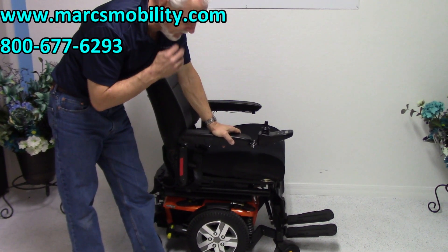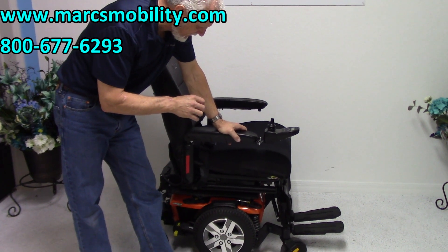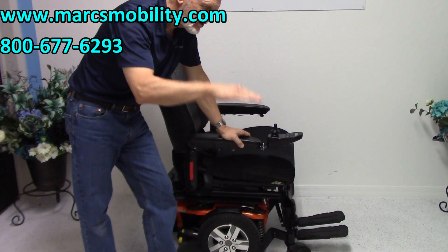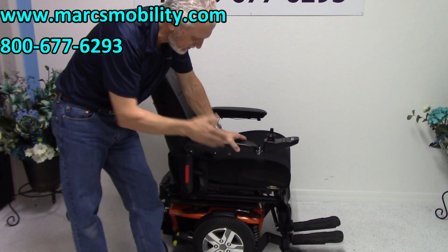This is a Pride Quantum Edge 2.0 I-Level. The only thing this chair has on this model right here is the 12-inch seat lift. So the only thing you're looking for is the 12-inch seat lift, which you would like to have.